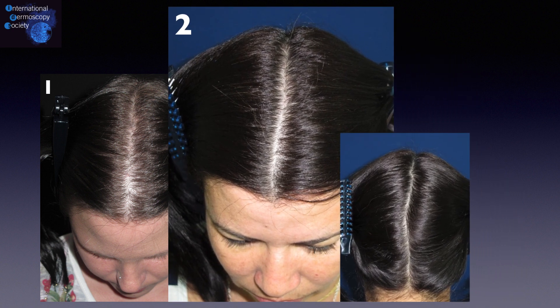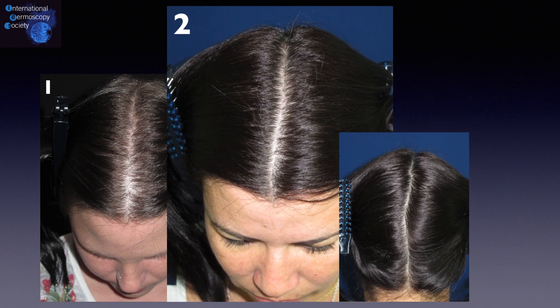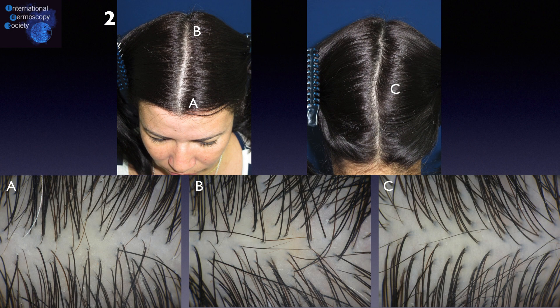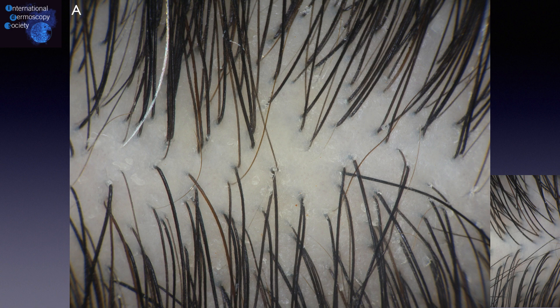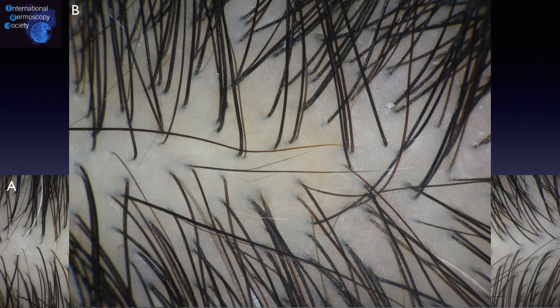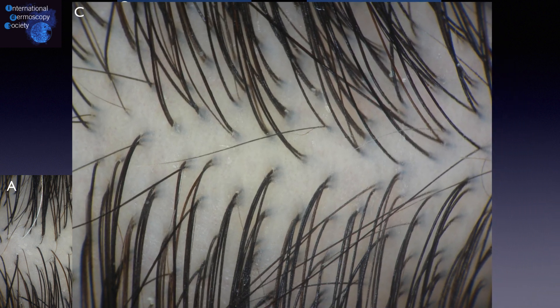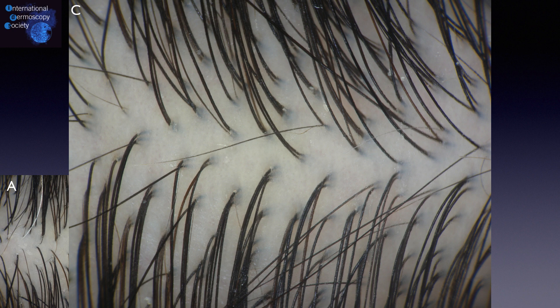In the second case, we can see many short hairs along the middle hairline. We will compare the same three areas as in the previous case. In the frontal area, we have good hair density and few thin hairs. In the vertex area, we have almost the same hair density and a lot of upright regrowing hairs, as also seen here in the occipital area.